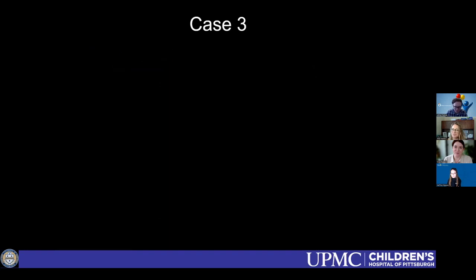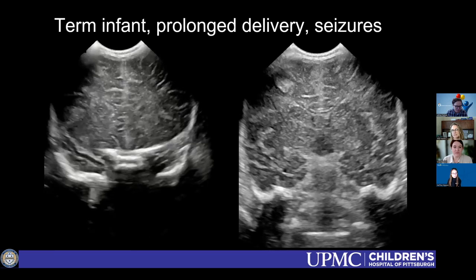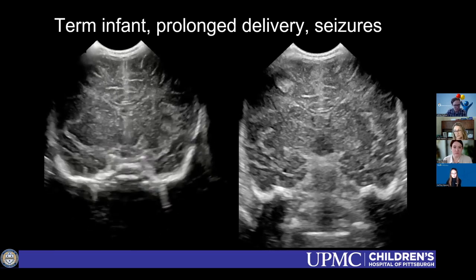Okay, let's move on to the next topic. So this was a term infant who had a prolonged, difficult delivery and who presented with seizures.